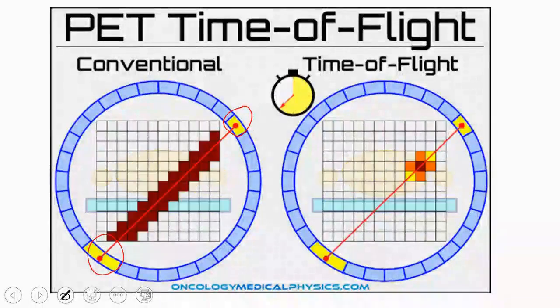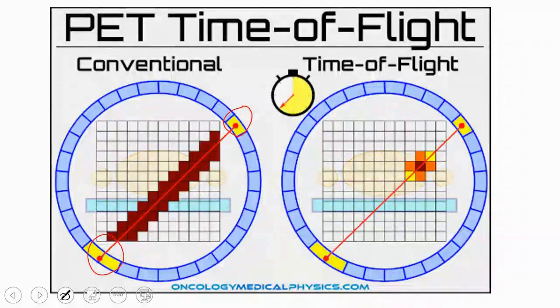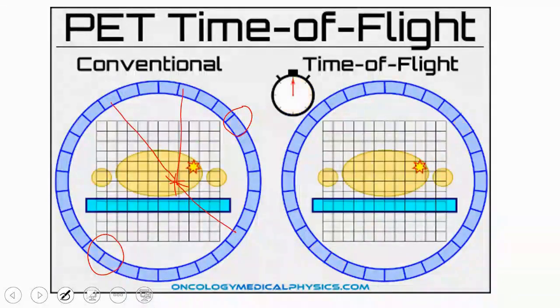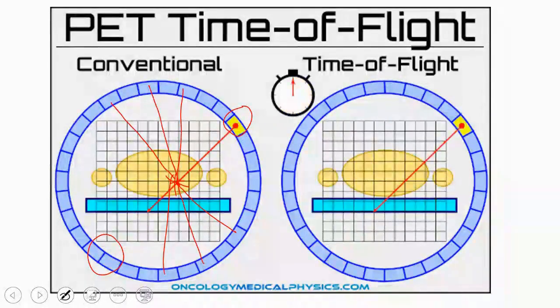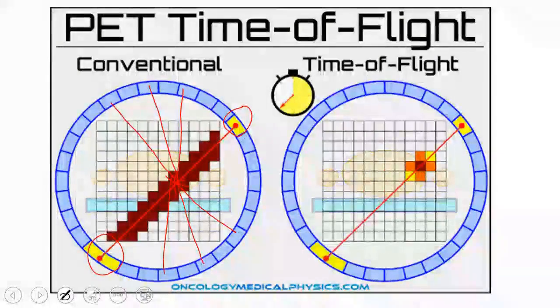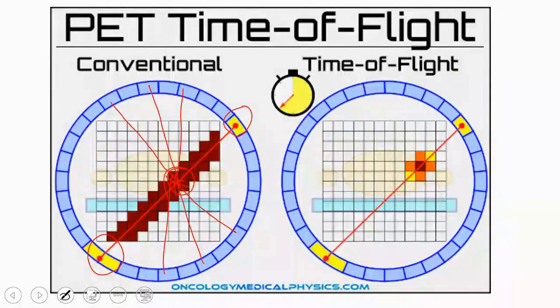I think about the concept of back projection. We used to say that the point where the annihilation occurs is exactly that point, right? This point will be the most significant point for me. Why? Because I will receive signals from here and from there, and I will receive from many places. So each 2 crystals will start to count the received signals and perform back projection on their line, on their path until the brightest point appears, which is the intersection between all these lines of response.